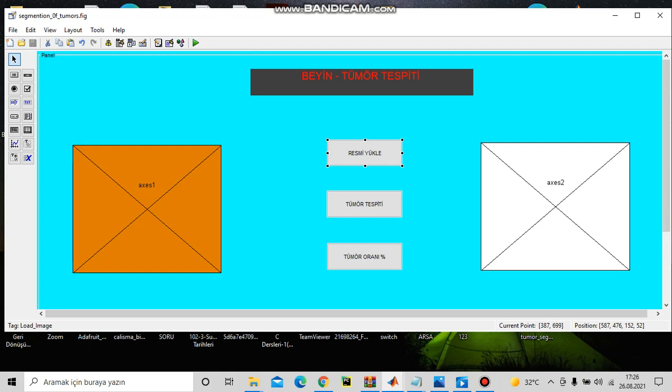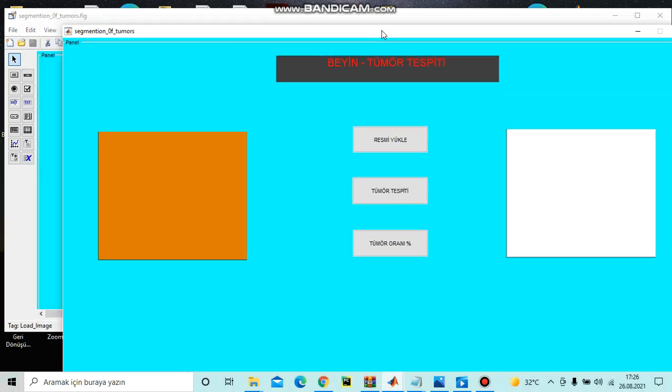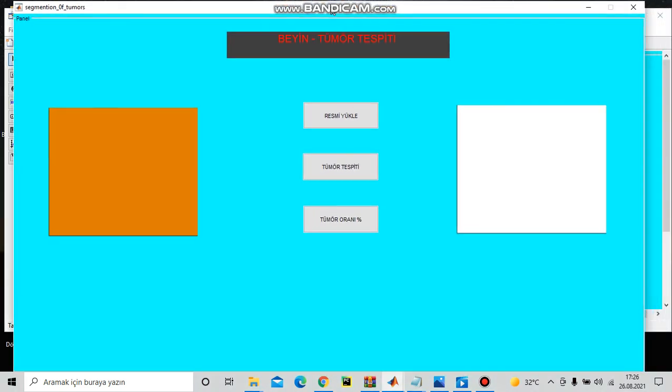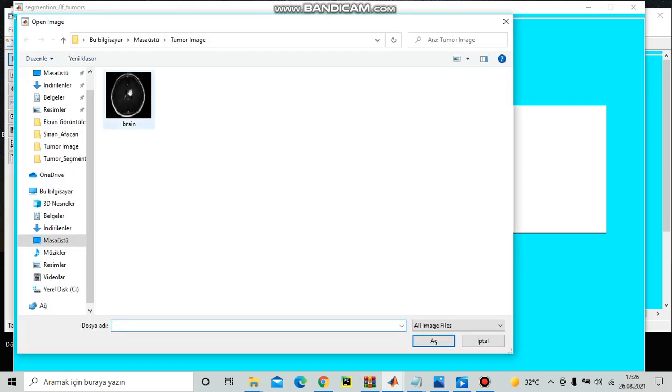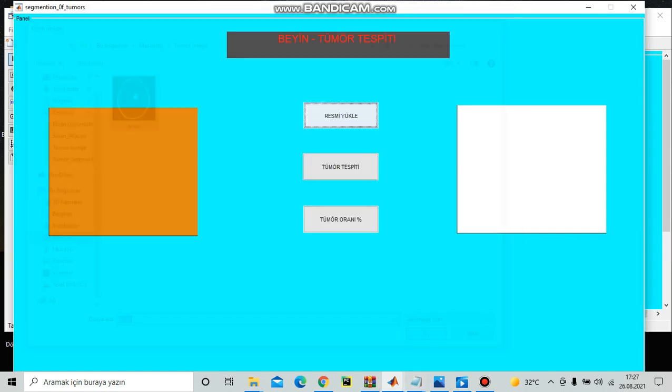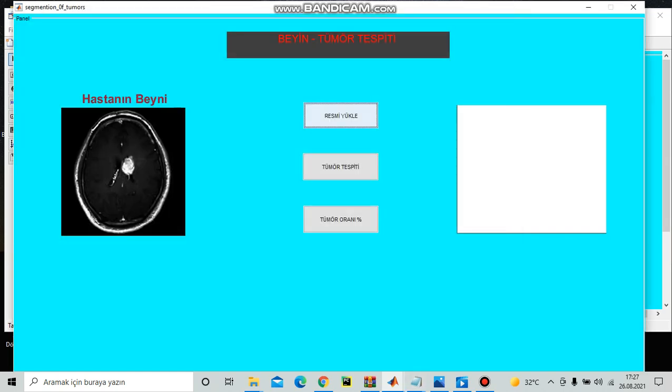Okay, I will run. As you see here our interface, load image. I'm going to load this one, this MR brain image, just open it. This is the brain. Also I will detect this area.